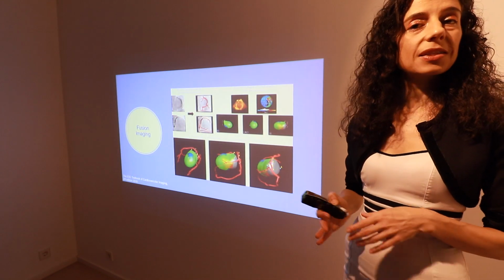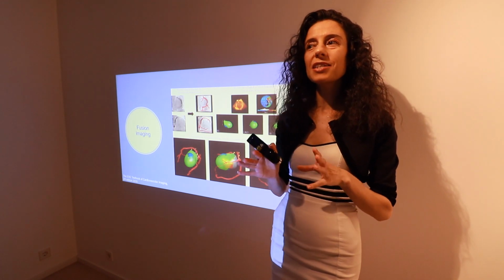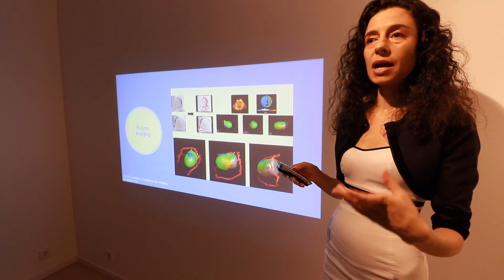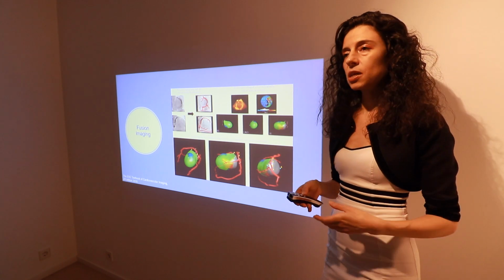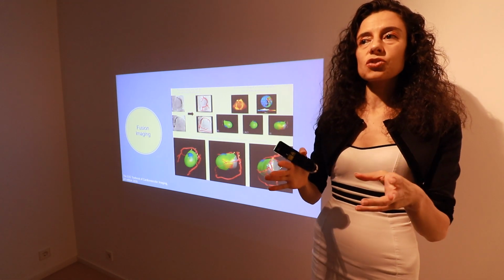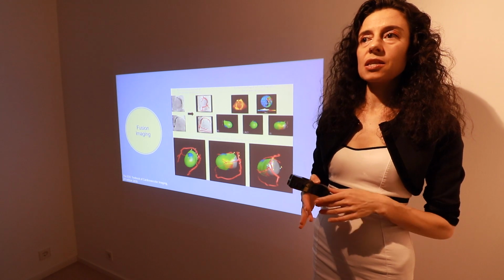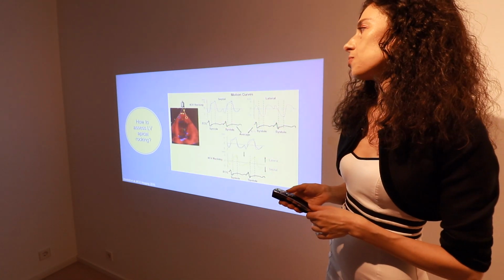tracking. A very interesting thing is the option to use fusion imaging. This is a way to fuse the image of the left ventricle with the zone of the maximal delay with the coronary venous anatomy in order to be able to select which branch would be most suitable to position the LV lead in order to provide the optimal synchronization of the left ventricle.